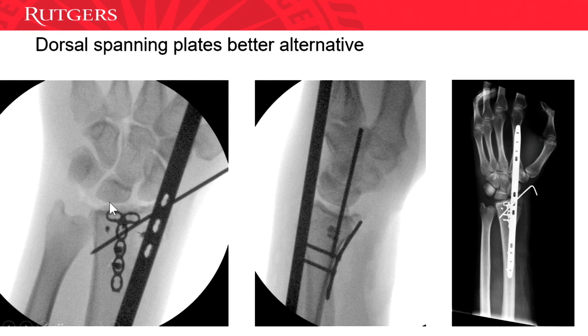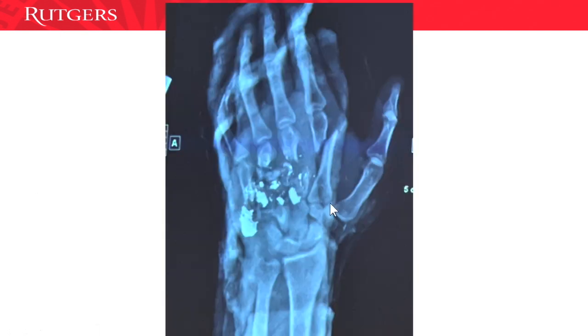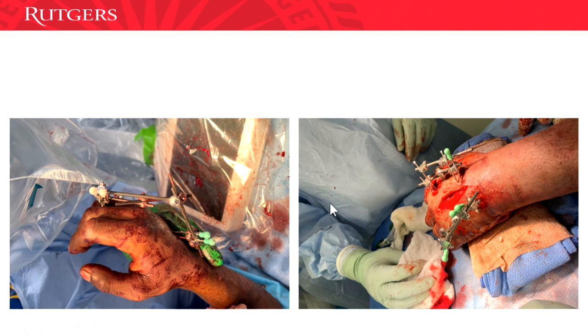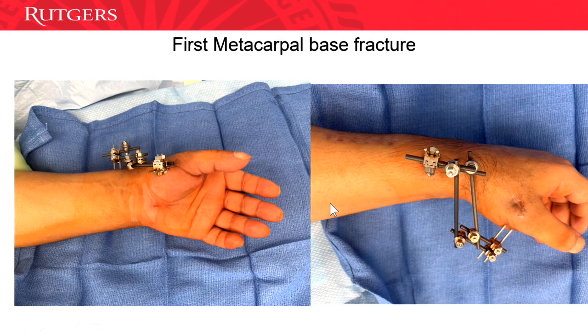And you want to look at the carpus, make sure your radiocarpal and intercarpal distance, this might be even a little over-distracted, because you can give them CRPS. And then, of course, you can put it in the metacarpals as well. But I guess, Matt, you'll probably be sending me those.